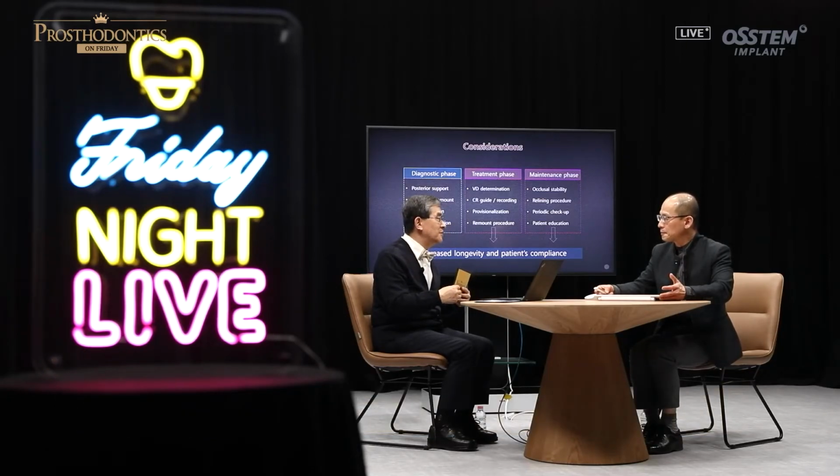After doing a full mouth case, myself also, I wonder when the patient will come back, because there's trouble. If there's trouble and it's a long bridge, you have to take everything out. So going section by section is also important. What do you think? Yes, of course, I agree.